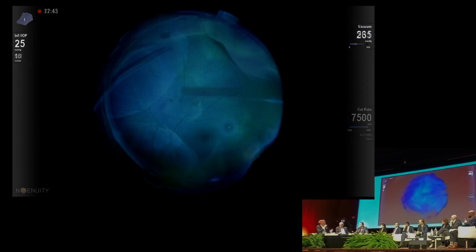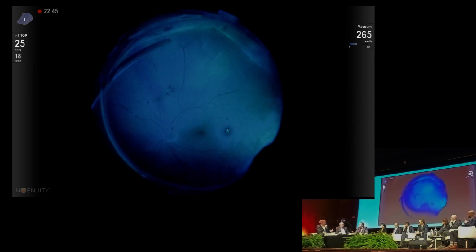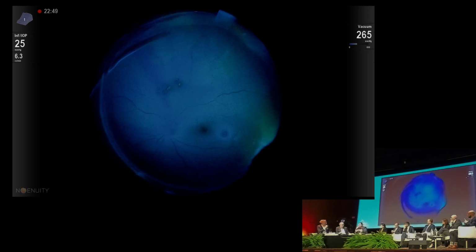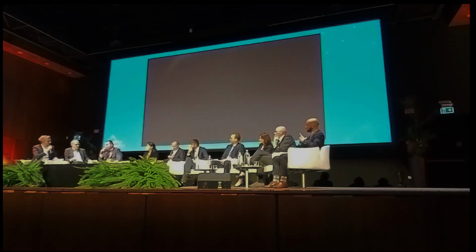The fluorescein angiography intraoperatively, how do you do it? It takes about 5 minutes, like a regular angiography, but you need to have an excitation light source in order to excite the fluorescein, and you need to have a digital filter recipe, in my case of the Ingenuity, in order to capture the fluorescence.